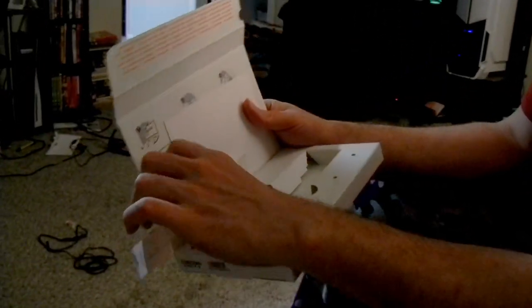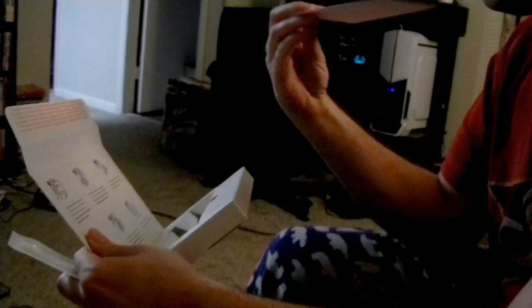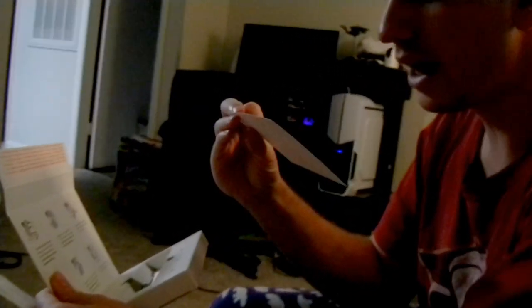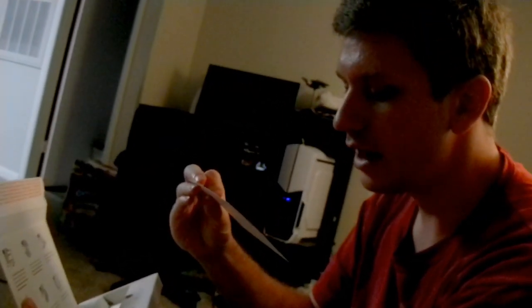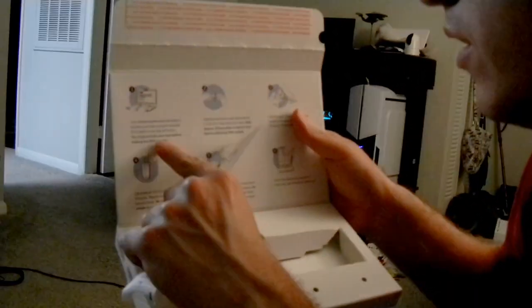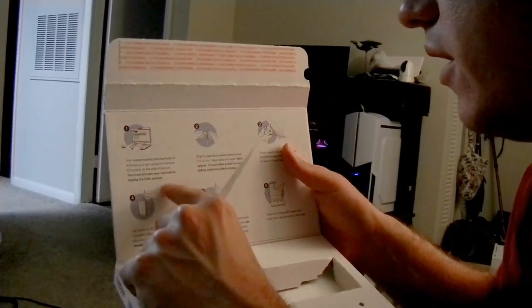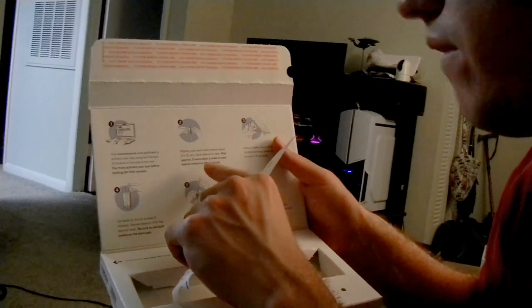The QR code—ready to collect your cat's DNA like a pro. Scan the code below. Visit the website. You must activate your test before mailing a DNA sample.